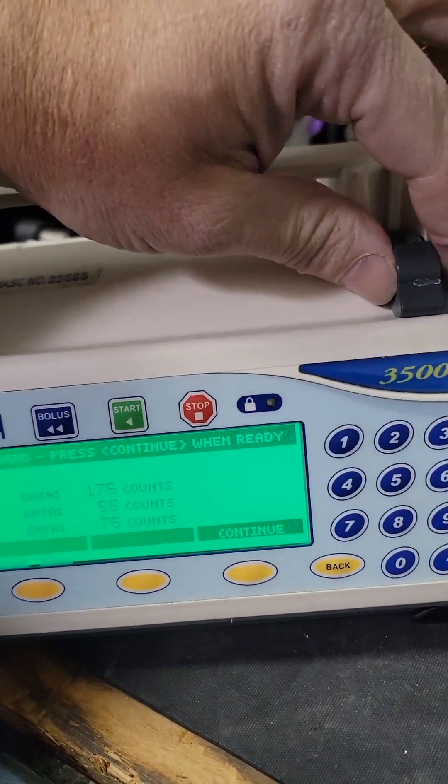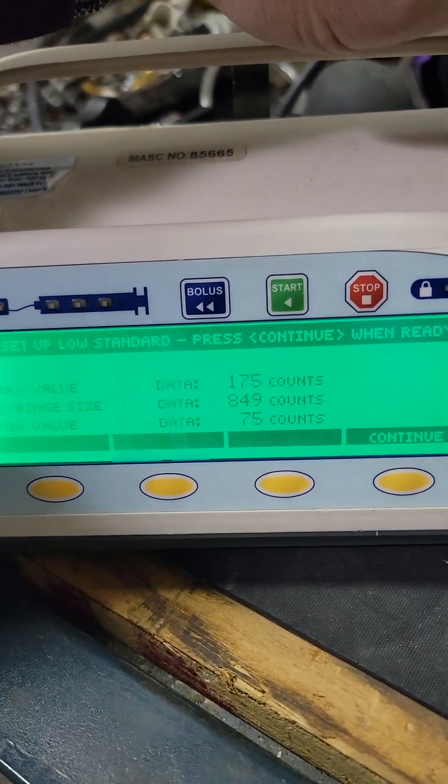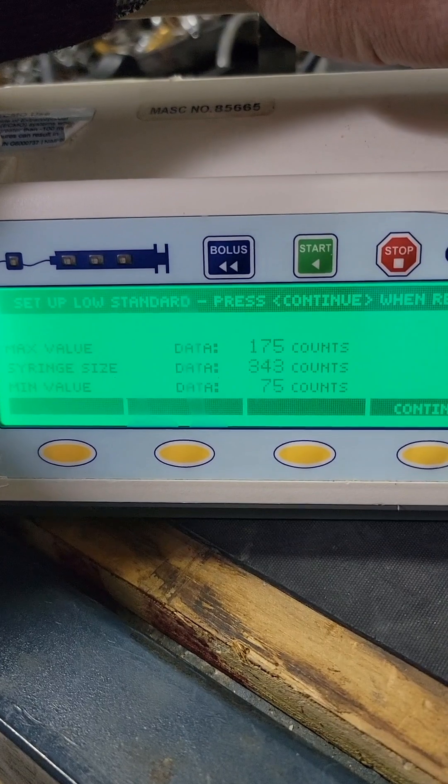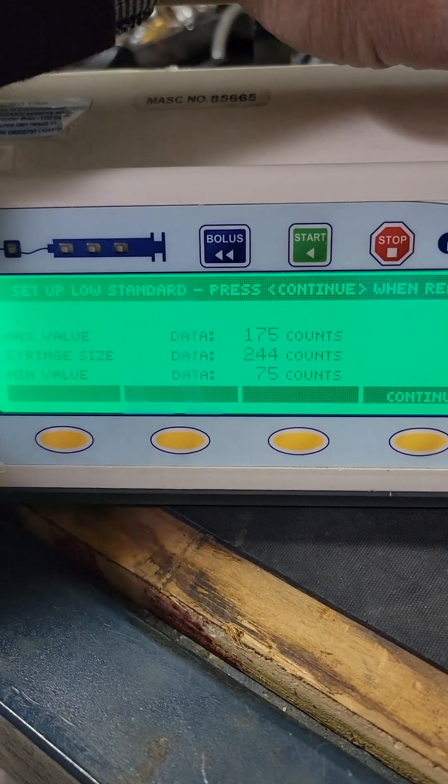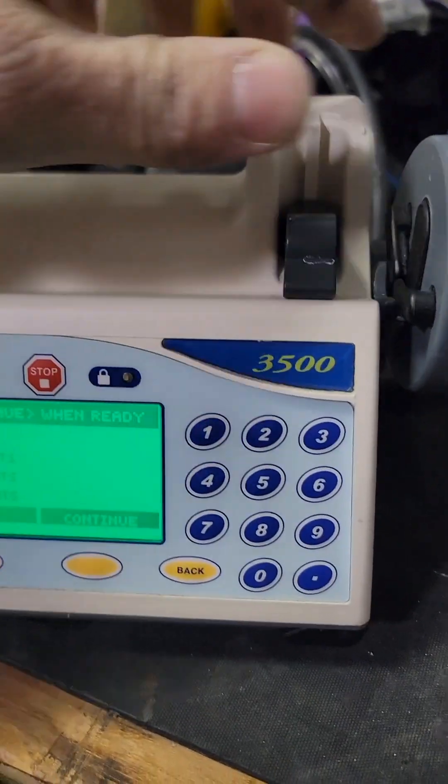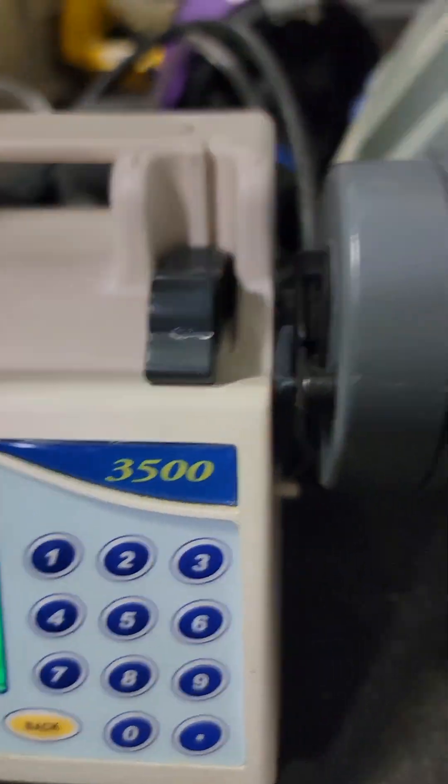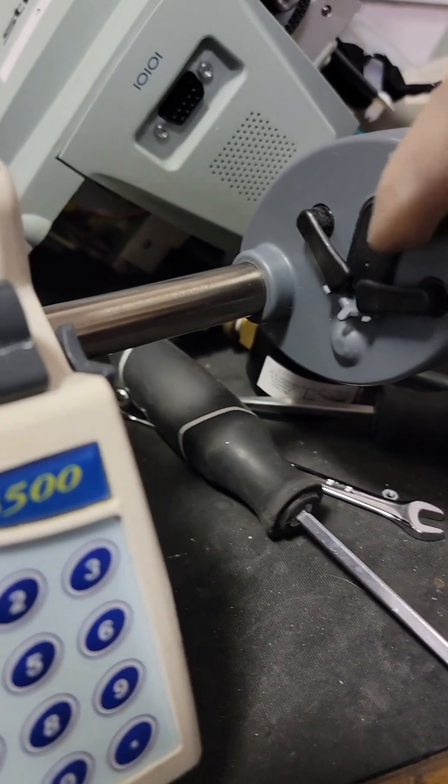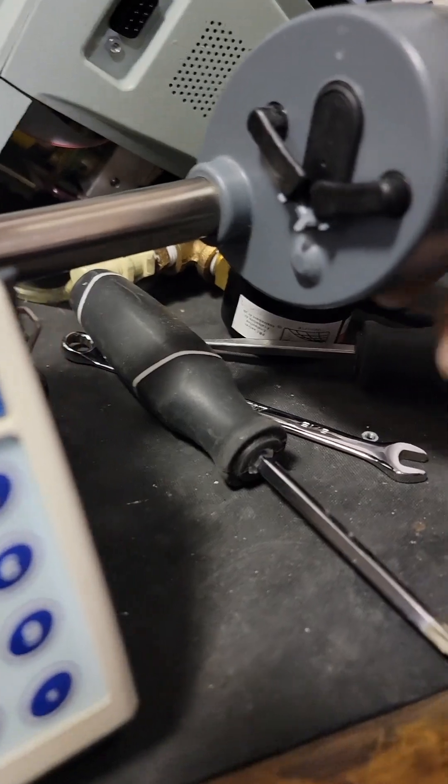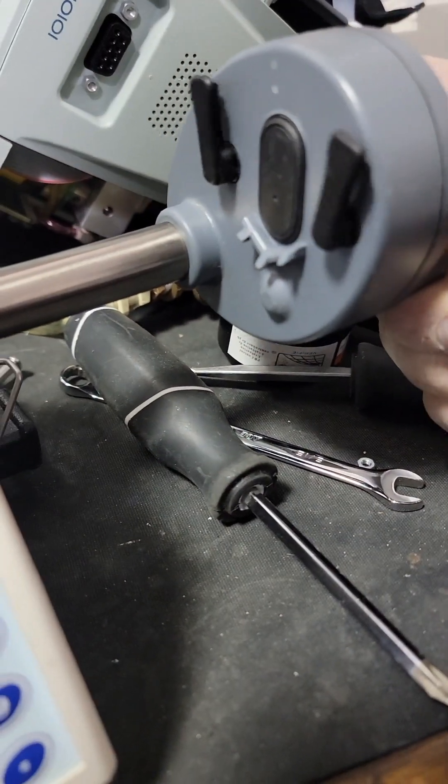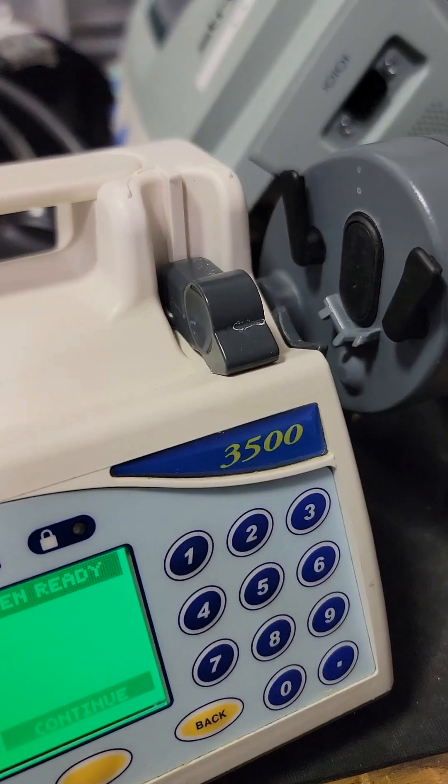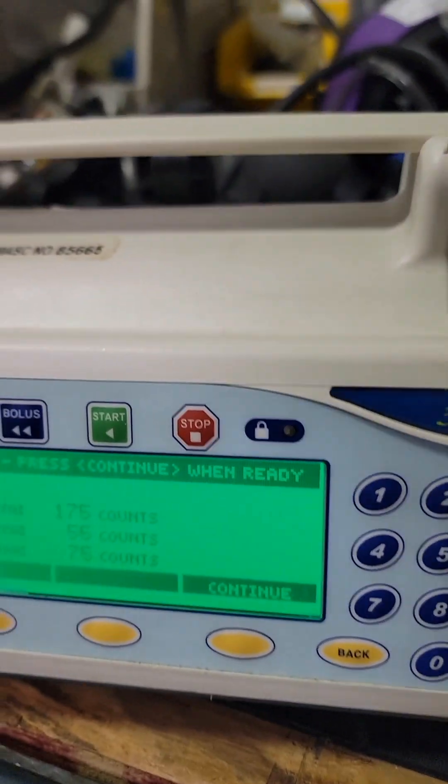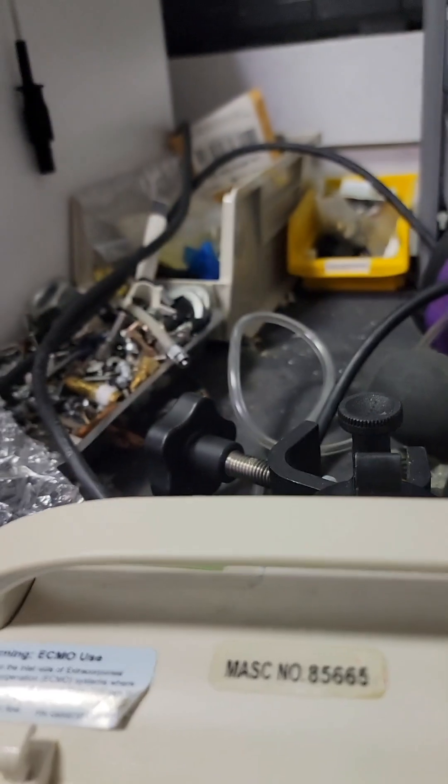The syringe size sensor is in the barrel clamp, so depending on the size of syringe you use is how far out this would be. Next is the syringe position sensor which is internal, it tells how much is left in the syringe. For this we're gonna start with the little guy.